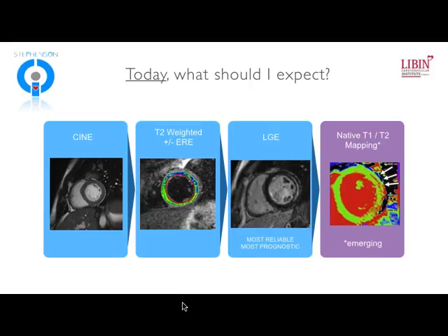T2-weighted imaging, I think, is going to maintain itself as part of the core protocol for some time. I think that a lot of clinicians, if they do see abnormalities on late gadolinium enhancement, are still going to want to know, is this a recent injury pattern or not? In isolation, does it identify myocarditis if you have no other abnormality on imaging? Probably not. There are maybe a couple of cases where it has been questioned whether or not you can have myocarditis with abnormal T2-weighted imaging and absolutely no late gadolinium enhancement. I think it occurs, but rarely.